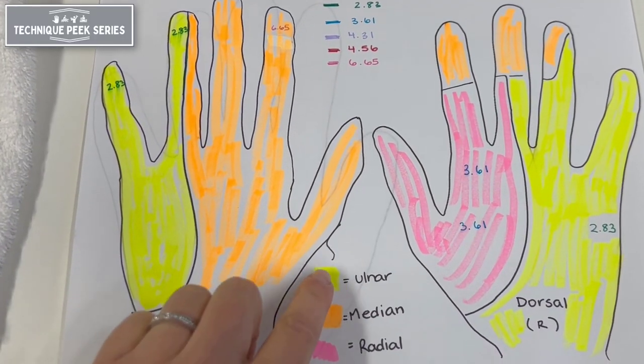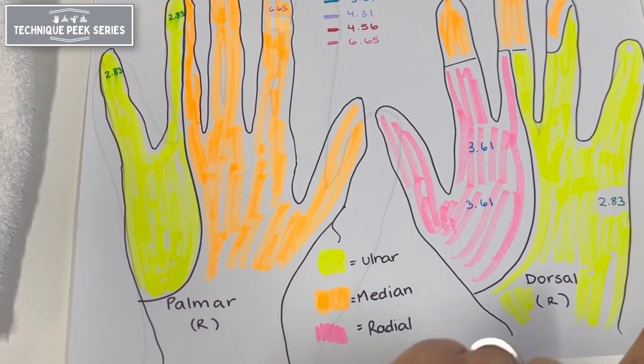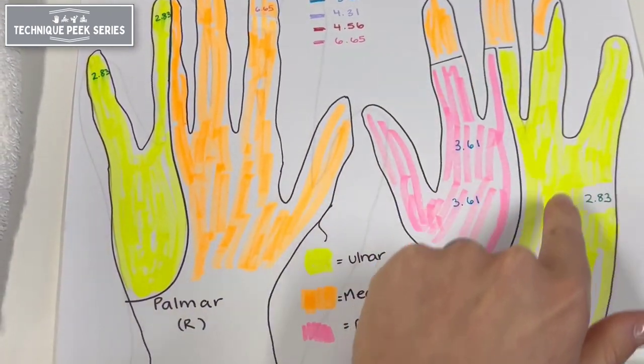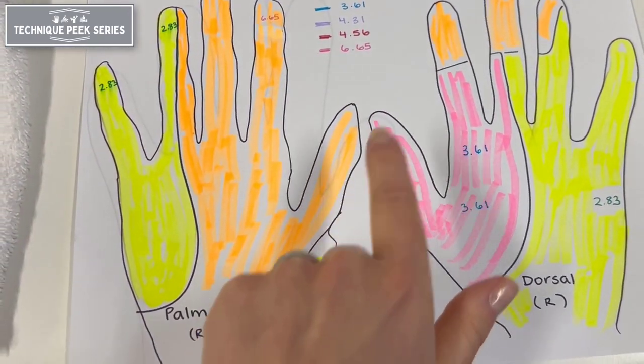This chart demonstrates the cutaneous innervation of the hand. In yellow you can see the areas innervated by the ulnar nerve, in orange the median nerve, and in pink the radial nerve.